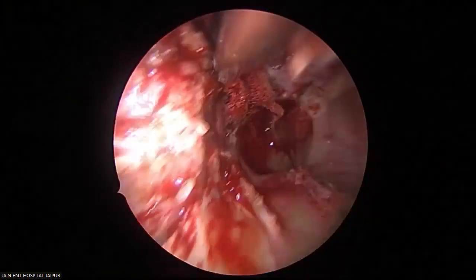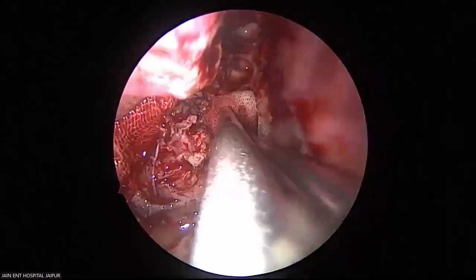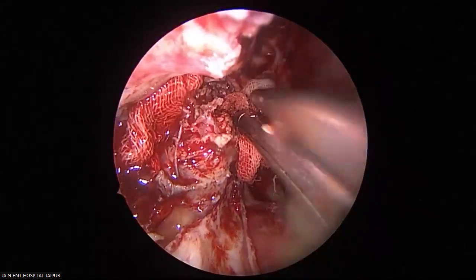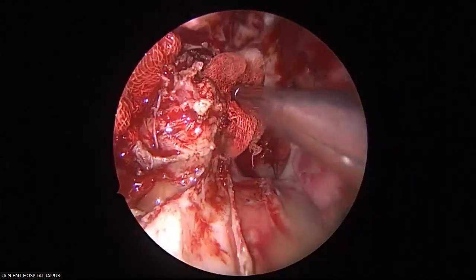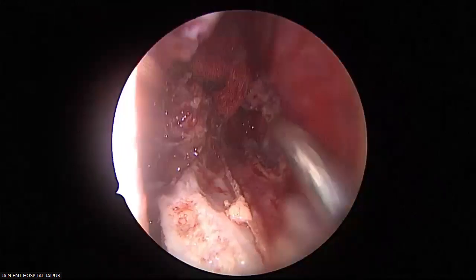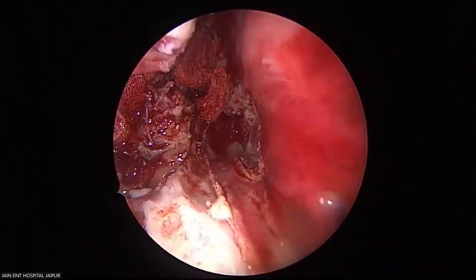So we have divided the tumor with a little bit of bleeding, which was acceptable. See this? Not the main part, we have a huge lobulated tumor laterally which we have to bring out. Watch please.